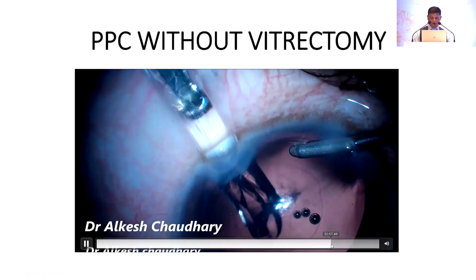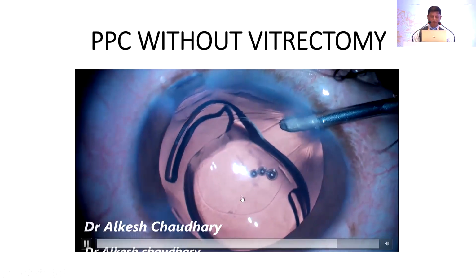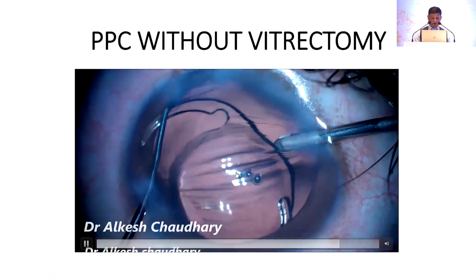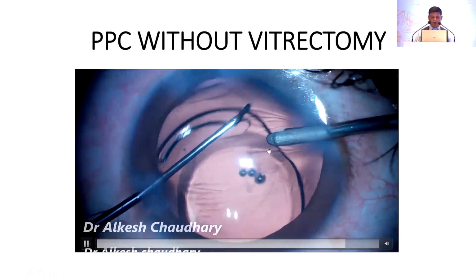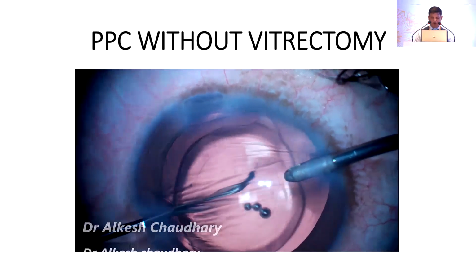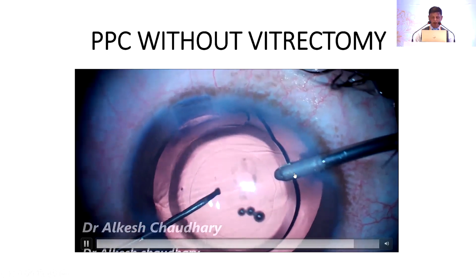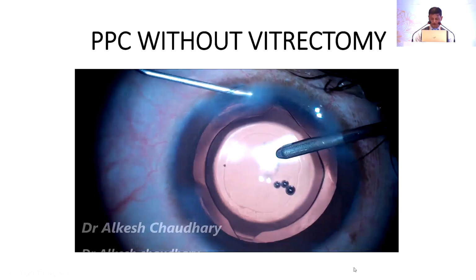So this time we could place the lens in the bag. You see this defect is not at all enlarged. So low vacuum, low aspiration, bottle height low. All these factors are how it prevents the further enlargement of this defect.